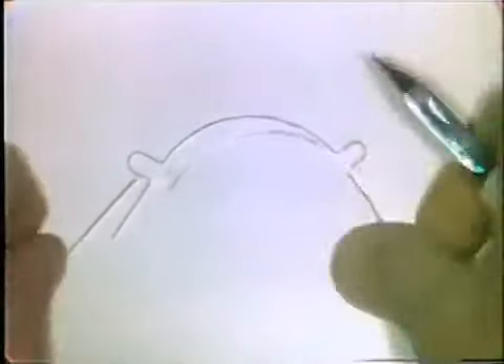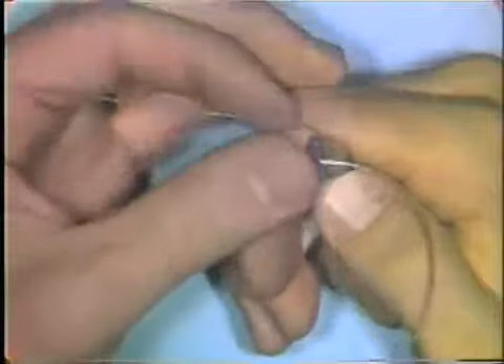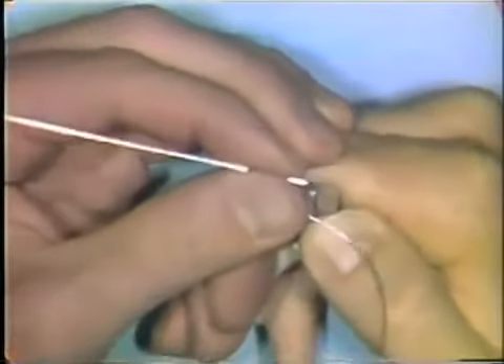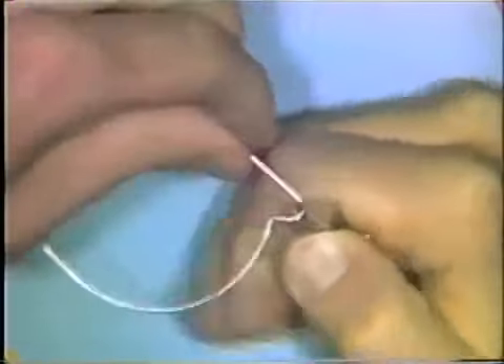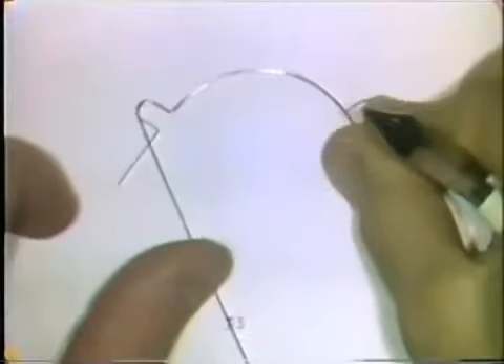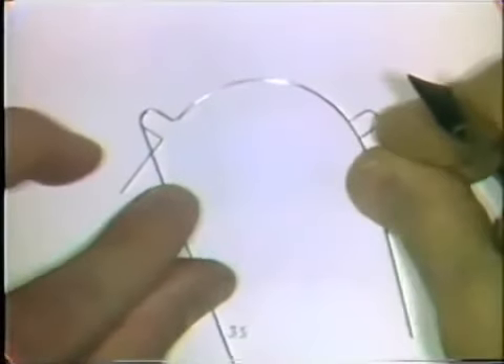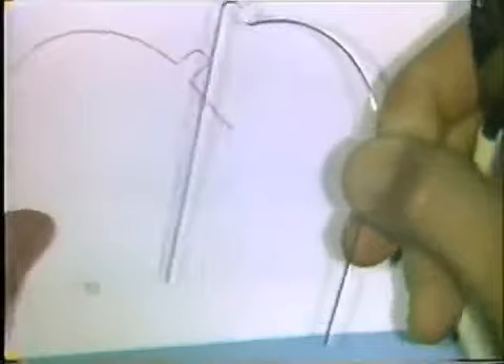This will orient you and let you know what you have to do. By pushing that wire over the round beak, you can form that loop. Check the loop on the pattern again to make sure you're moving along properly, and if you're satisfied with the curvature, continue and complete the formation of that loop.